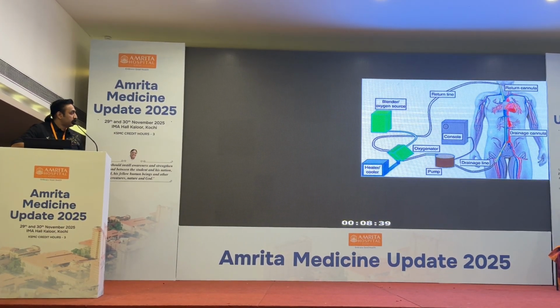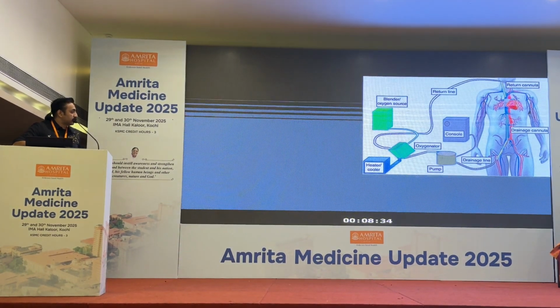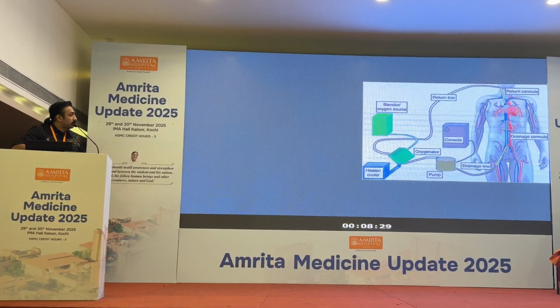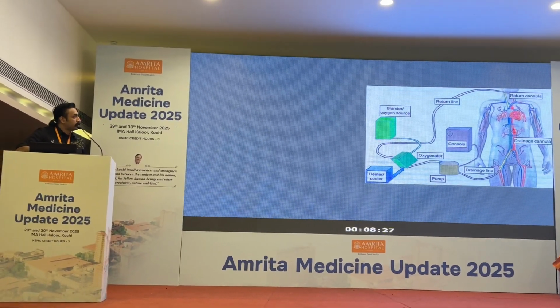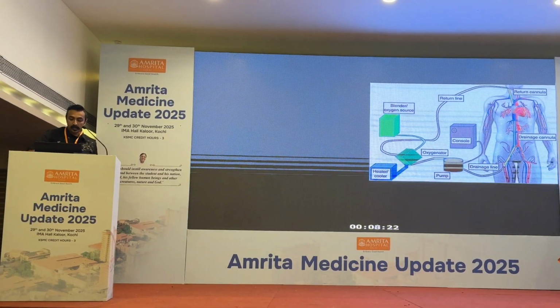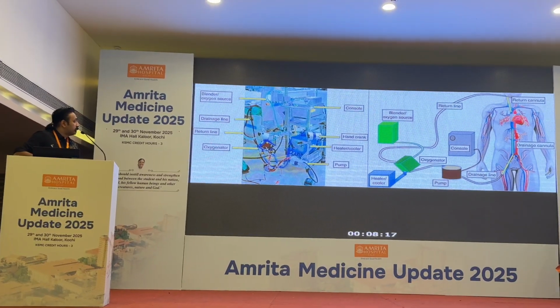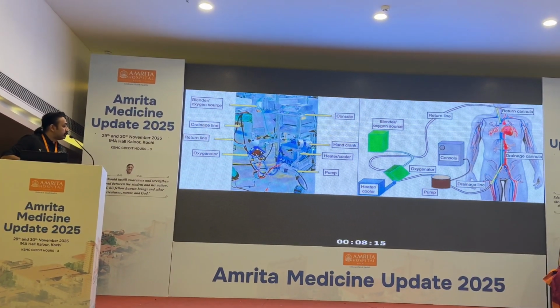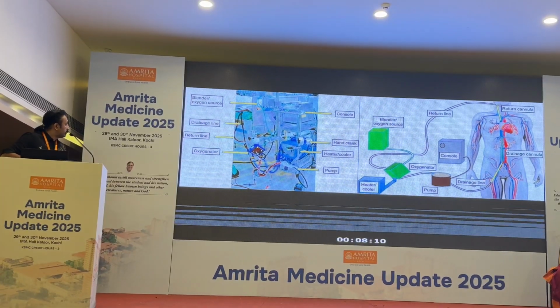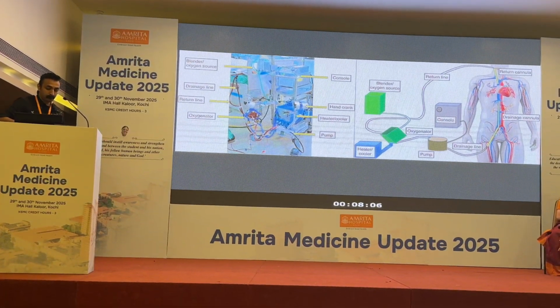So if you see from here, you have the drainage cannula into the pump, an oxygenator which is connected with the blender and the heater, and this goes back into the patient. Here you see it's from a femoral vein into the internal jugular, a veno-venous kind of circuit. And this is how your traditional ECMO machine would look. You have a console, you have a hand crank in case of a power failure and things like that, and you have a pump, the oxygenator, the return cannula, and the blender and oxygen source as seen there.